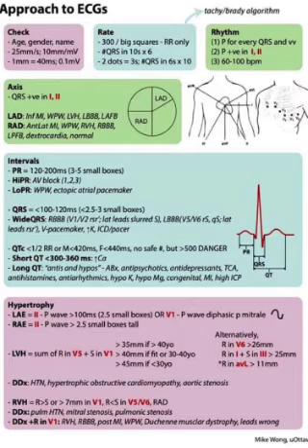Hypertrophy: left atrial enlargement shows in lead 2 a P wave more than 100 milliseconds, 2.5 small boxes, or in V1 the P wave is biphasic, with P mitral morphology. In right atrial enlargement, the P wave is more than 2.5 small boxes tall, that is P pulmonale.